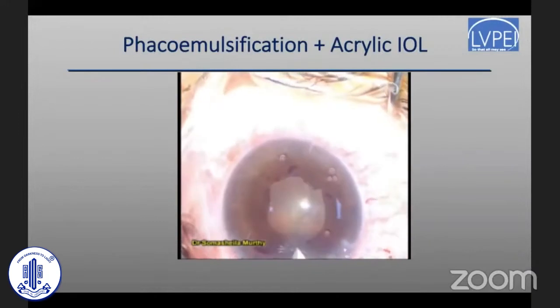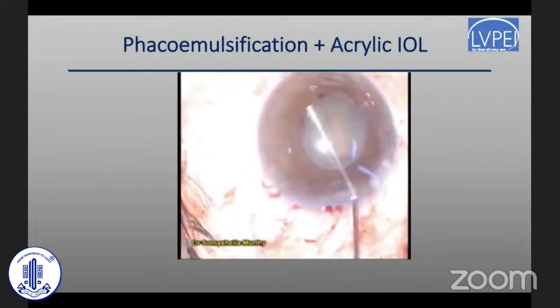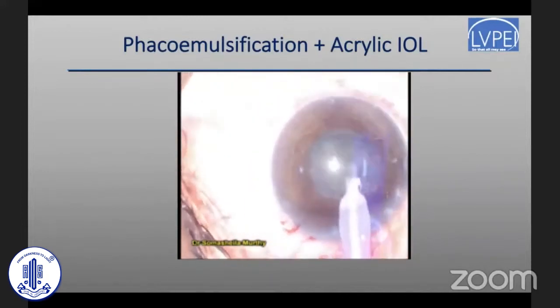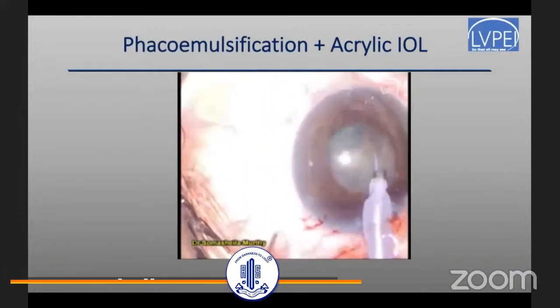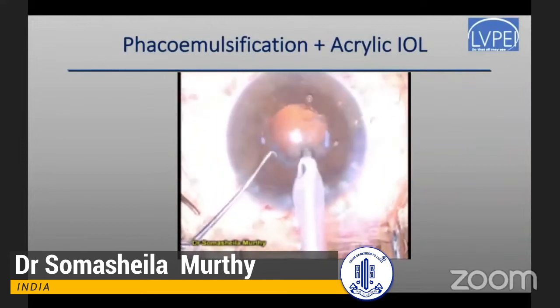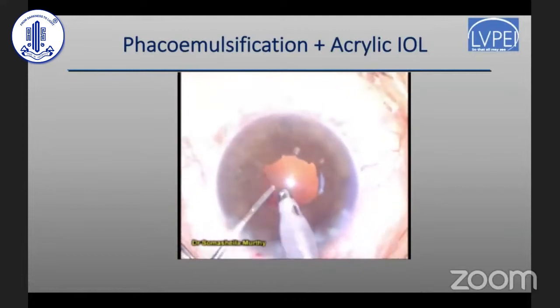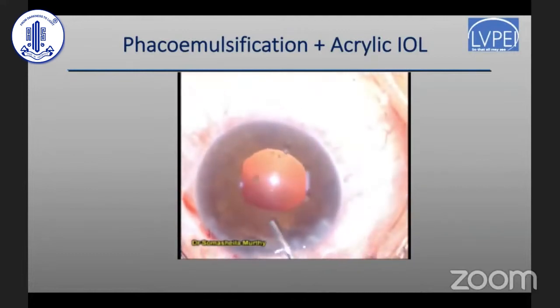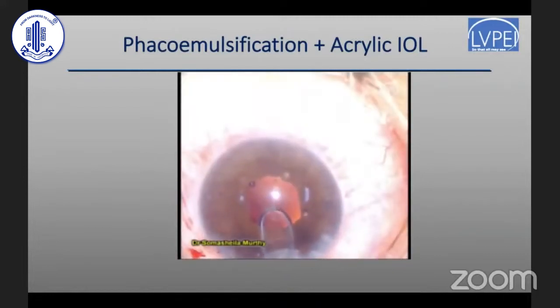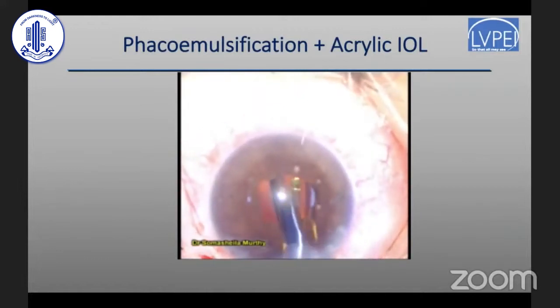After initiating the rhexis with a cystotome, the capsulorrhexis is completed with the help of microforceps. This amount of pupil size is adequate to safely perform cataract surgery, especially since the cataract is usually very soft in young patients. After hydrodissection you can notice the nucleus is grade one to two, and by simple phaco aspiration with minimal energy the entire nucleus can be brought out. This is followed by very thorough cortical cleanup to ensure no inflammatory cortex is left behind.